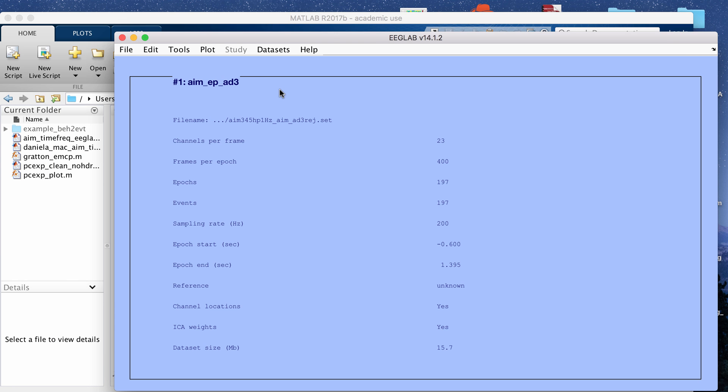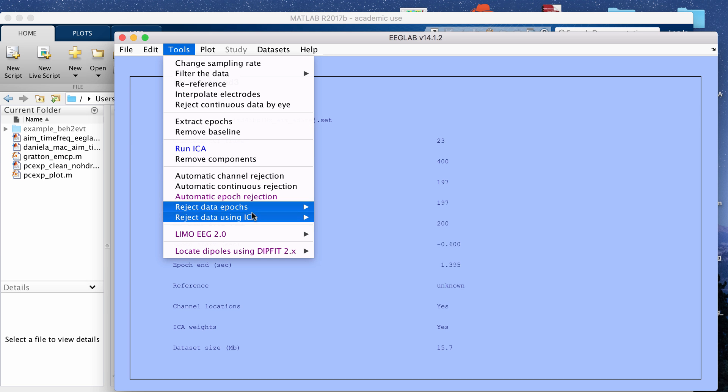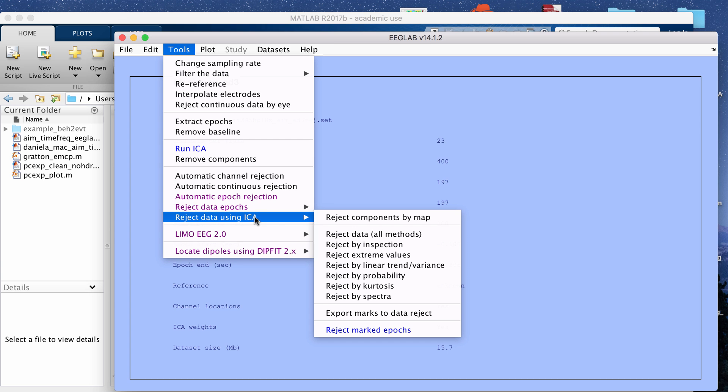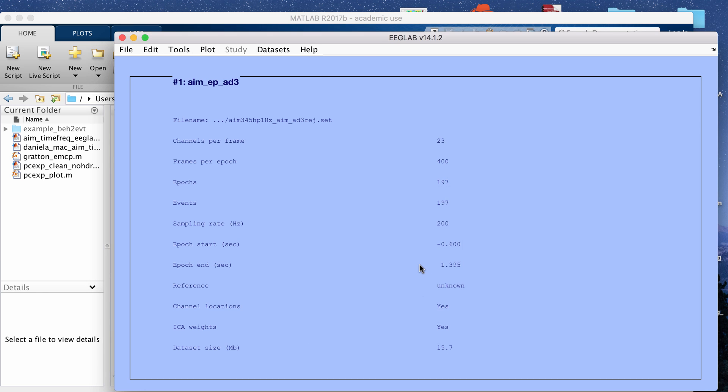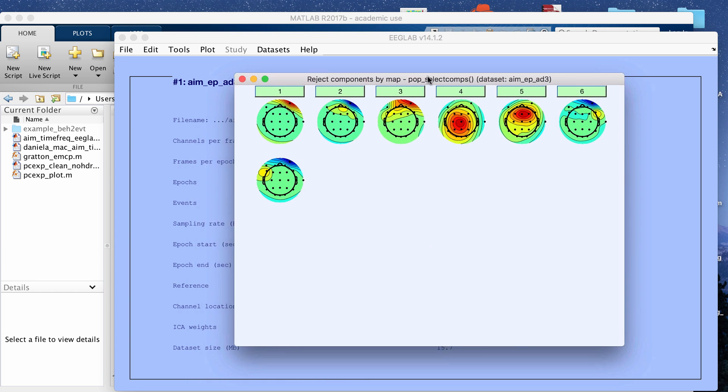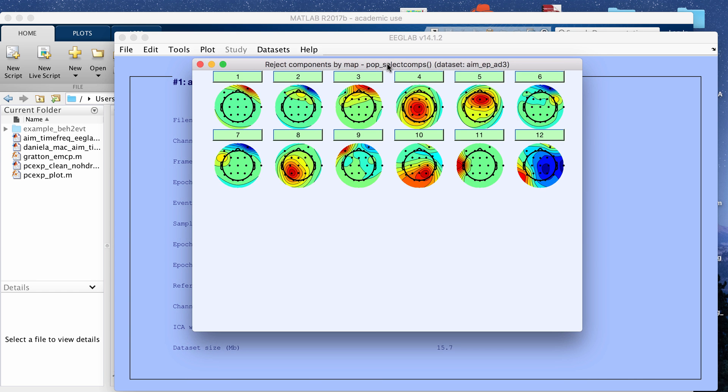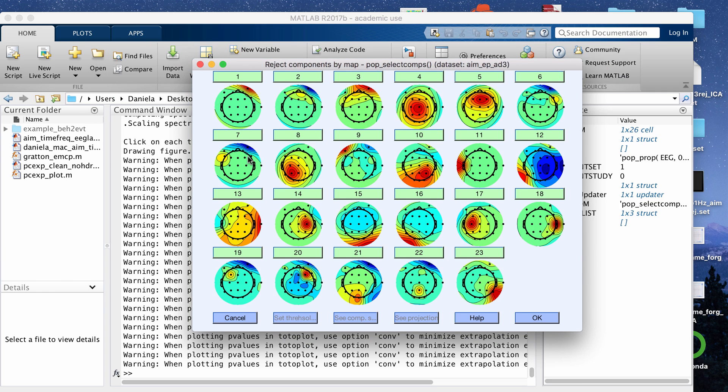Then there's another way of looking at this as well. You can go to tools, reject data using ICA, and then click reject components by map. I'm going to plot the 23 electrodes or 23 components that I have and then that will open up this window and then you can check each individual component by clicking the green button above their topography maps.